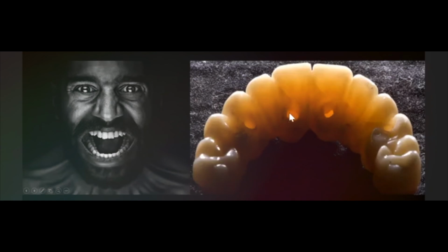So always when we have big cases, especially with these sensitive materials, we need to change the firing schedules, because otherwise we will make some problems and then we will complain about materials, but the problem is not the material. The problem is our technique. And of course, if you have a big case like this, it's not possible to bake it like a 3-unit bridge. You need to apply totally different parameters.